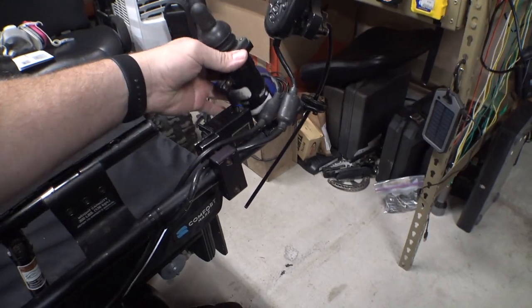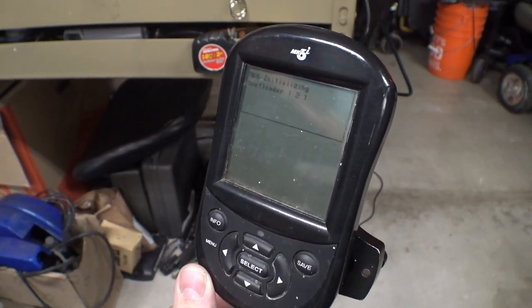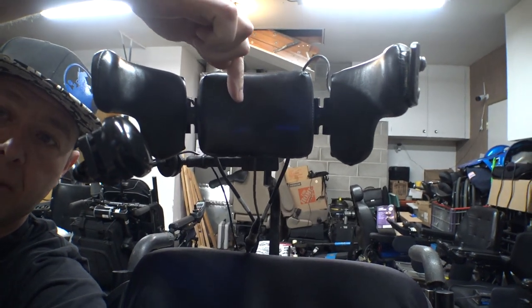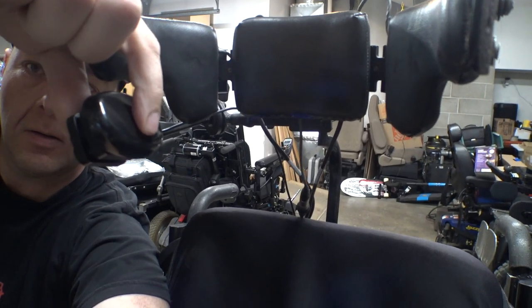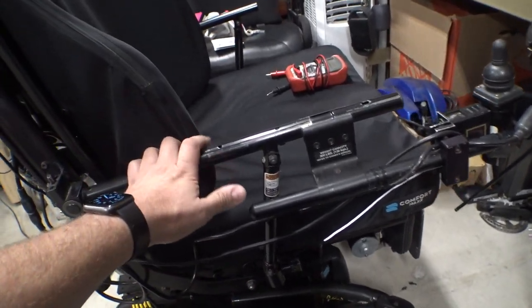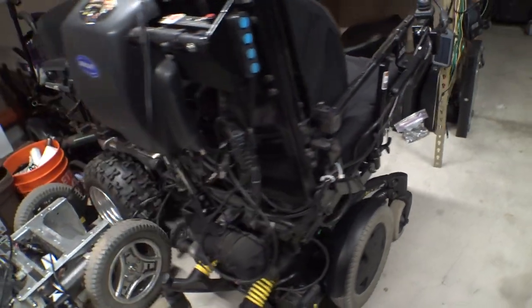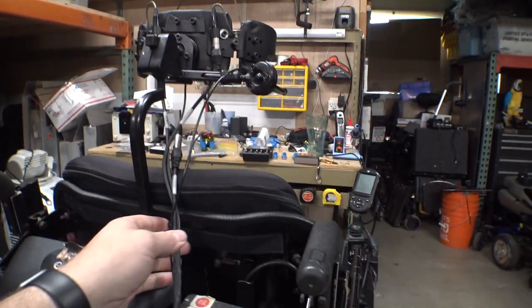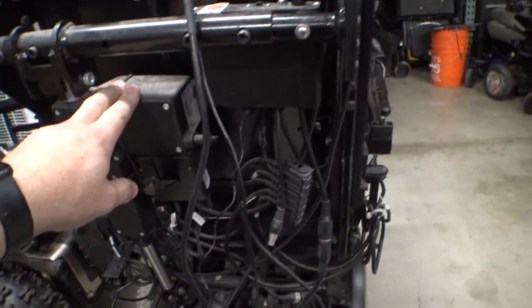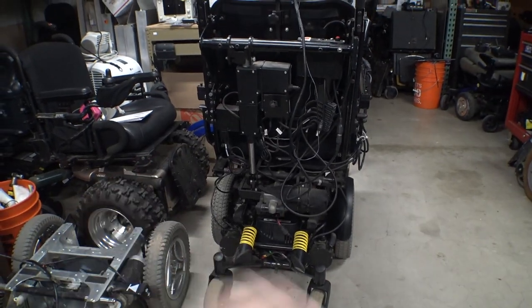I think usually there's a mount that this can go on on the back. It's got Invacare's version of the Omni to control everything. But this thing uses proximity switches — you actually don't have to physically touch the sensors. There's three of them: one in the back, one on the left, one on the right, and then there's a chin switch. That's used for switching through the different menus and modes and things on the chair. I've already done a little bit of work on this — taken off some of the armrests and tightened things up. I haven't messed with the wiring too much yet, but as you can see, these chairs that use head arrays have a lot of wires and a lot of extra modules to control everything.